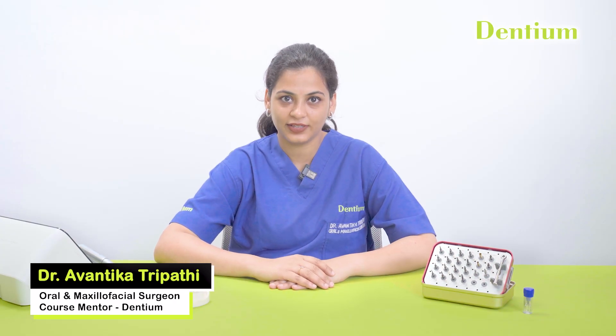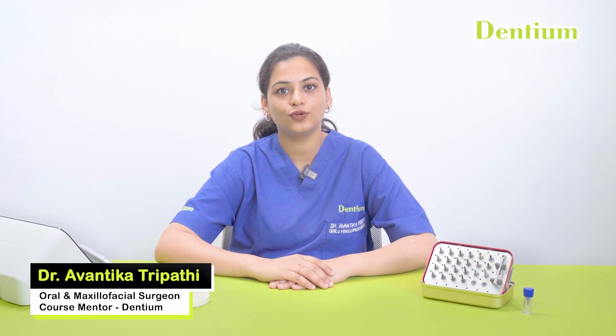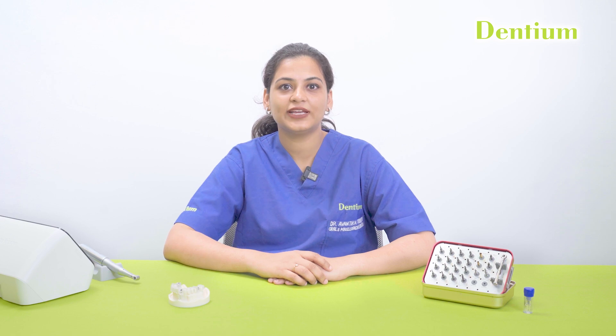Hi, I am Dr. Avantika Tripathi, Oral and Maxillofacial Surgeon, course mentor at Dentium. Today, I will be explaining about the Dentium Superline Guided Surgery Kit, a highly precise system designed for predictable and efficient implant placement. I will also demonstrate it on a dummy model to give you a clear understanding of the step-by-step process.